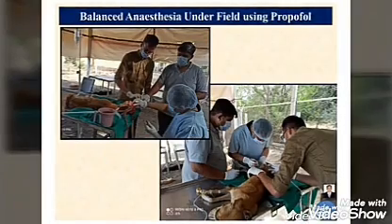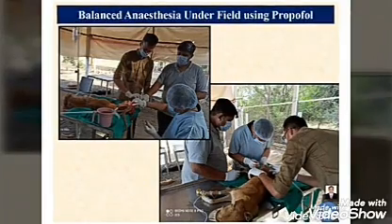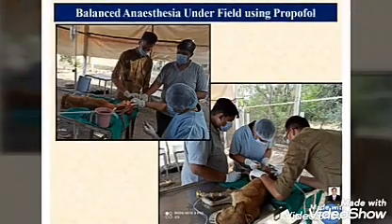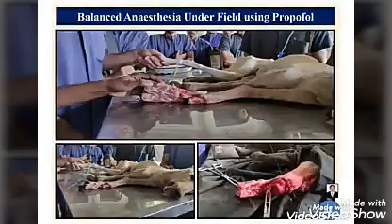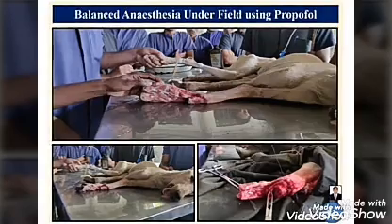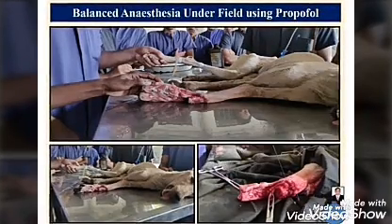So a tumor mass was successfully excised under the same anesthetic protocol in a canine with the help of an NGO and UG students during the lockdown period. And this is a demonstration of this balanced anesthetic protocol in a dog to our UG students at the veterinary clinical complex during OPD hours.